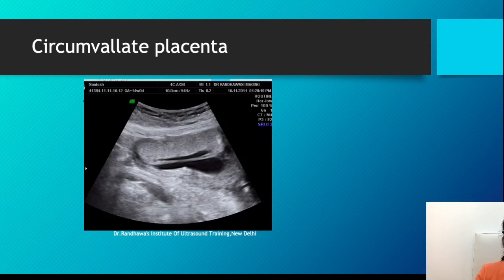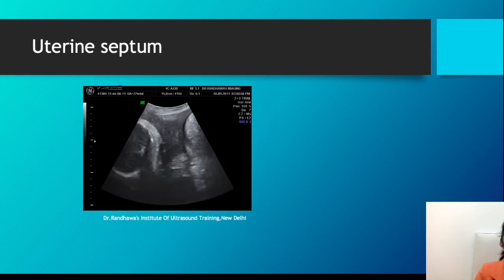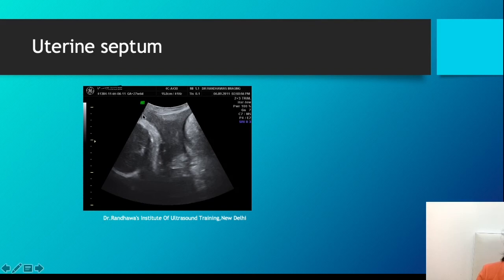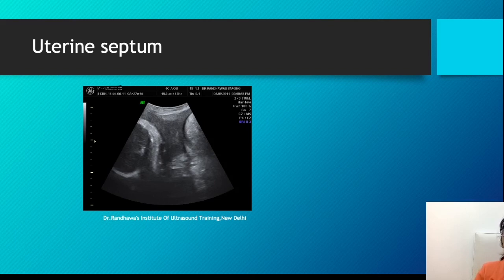Uterine septum should not be confused with these entities because most uterine septums are much thicker and contain myometrium. You can notice the continuity of the myometrium - they appear darker and are usually much thicker, especially at the base where they originate. You can follow the septum and see that it arises from the fundal region, distinguishing it clearly from the other membrane-like entities.